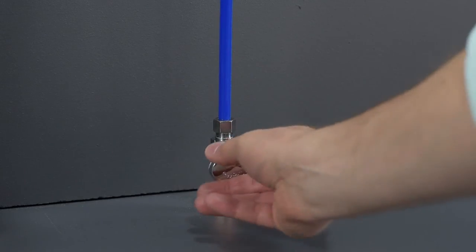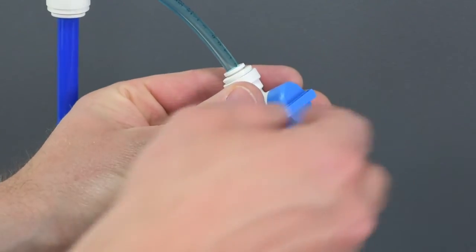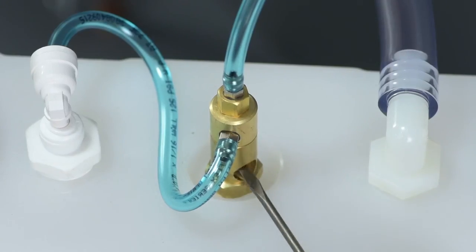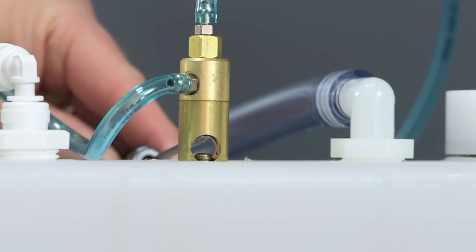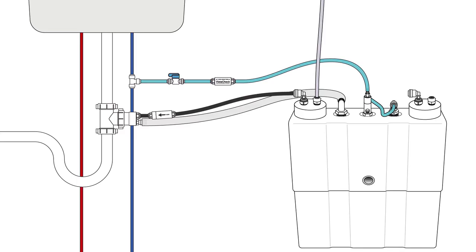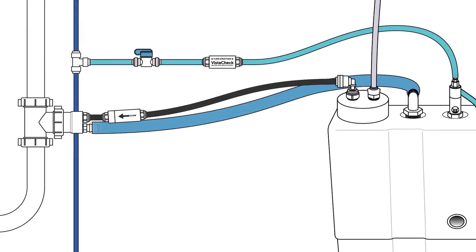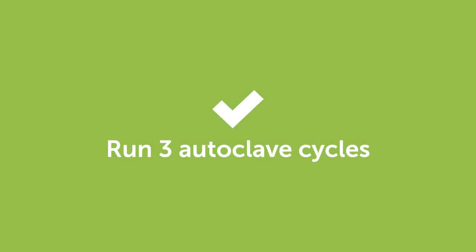Turn on the main water supply and check for leaks. Slowly open the inline water supply valve fully and check for leaks. Prime the system by inserting a small screwdriver in the viewport hole on the brass stem of the thermal regulator on top of the tank and pushing up on the water valve piston. The system is primed when water can be seen leaving the ½ inch overflow fitting on the tank and running to the drain adapter. Check again for leaks, then run 3 consecutive autoclave cycles to ensure everything is working properly.